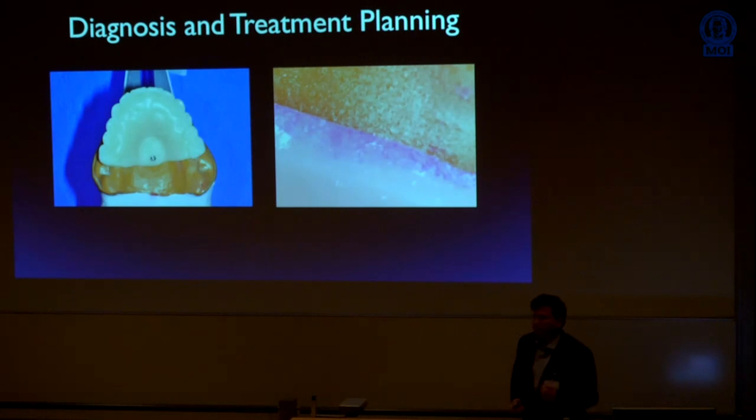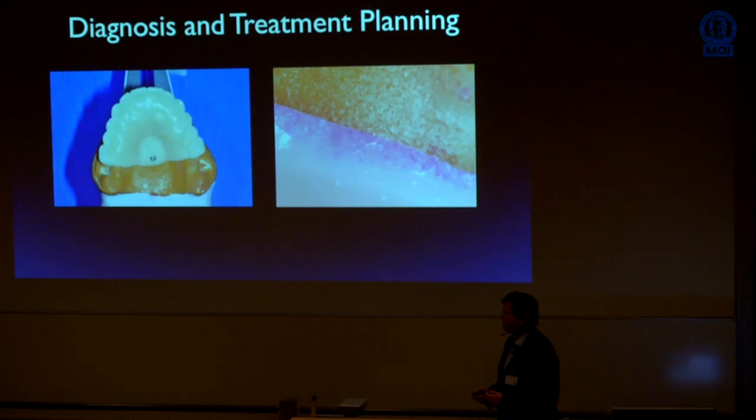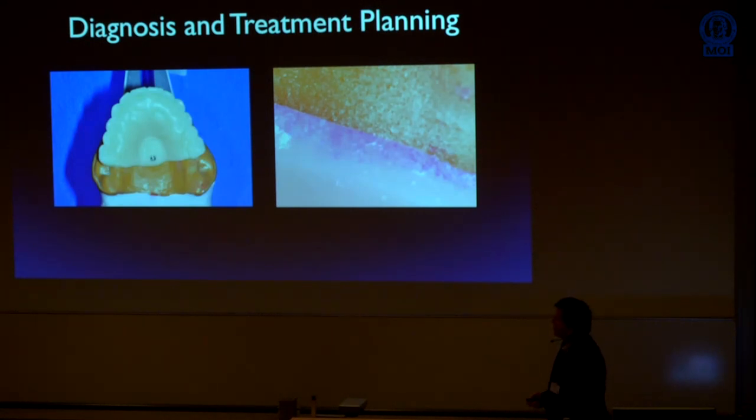Soft tissues in the palate are very well bound down. Some people may say, well, you're scanning soft tissue, how is that going to be supportive? Well, palate seems to not be a problem. So these are exclusively supported by the palate.